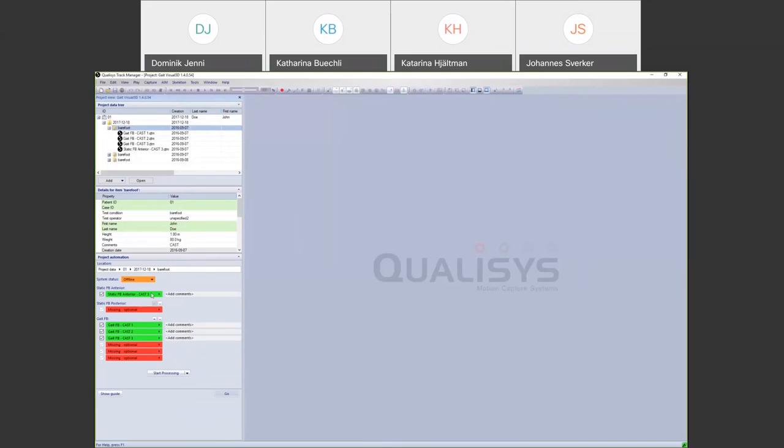During capture, the module guides you to make a static recording and a certain number of dynamic files, which includes gait force plate data.